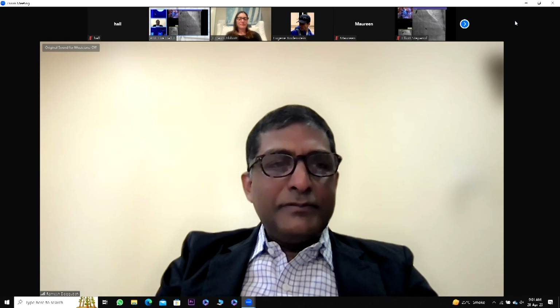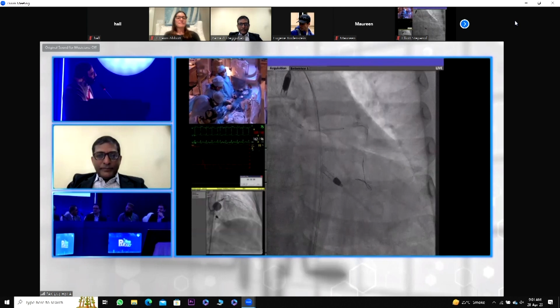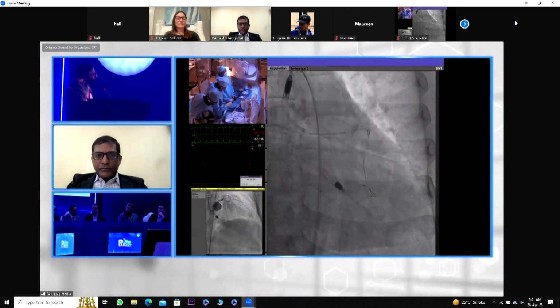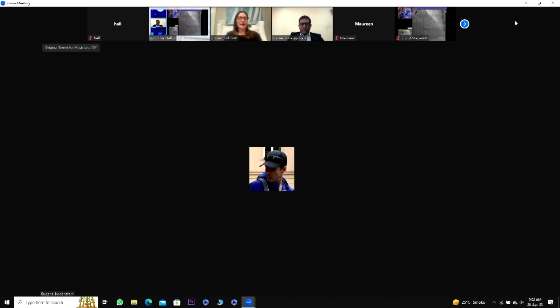So, Bashir, usually I will keep the wire in the side branch before ballooning the crush. But after first kissing, I will remove the side branch wire. Thank you. Yeah, Shaolin, I'm with you on that. Yep, I agree.